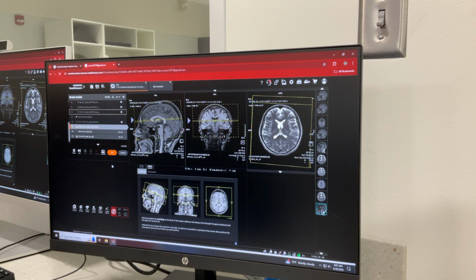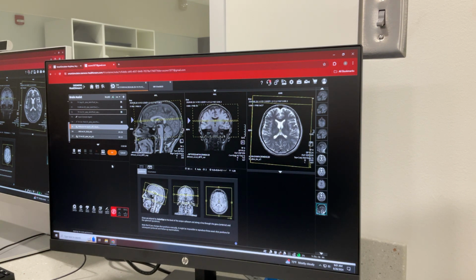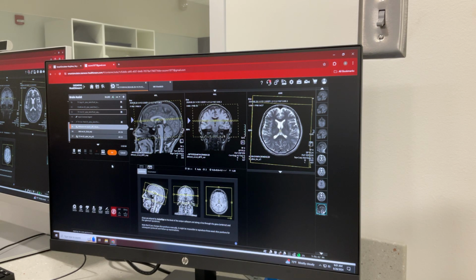Yep, it's gonna move a bit because we're moving it right to left. This is our field of view, it looks nice and centered now, and then we just come off this angle just a little bit. So see how that other line pops up? And now you can see how that one's kind of parallel.